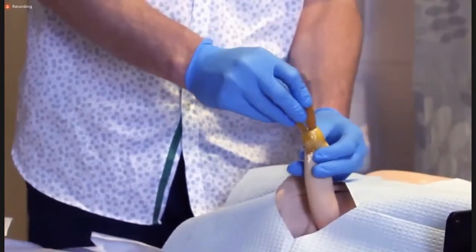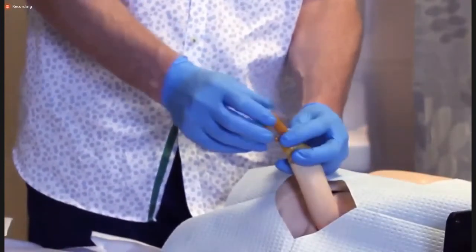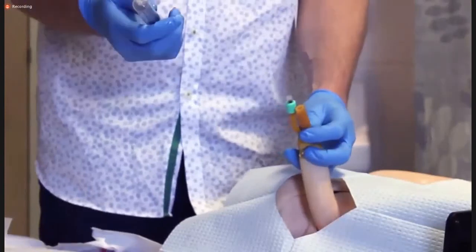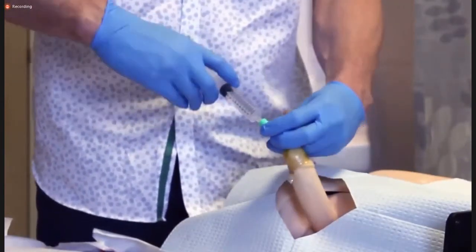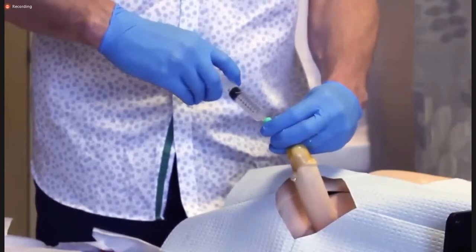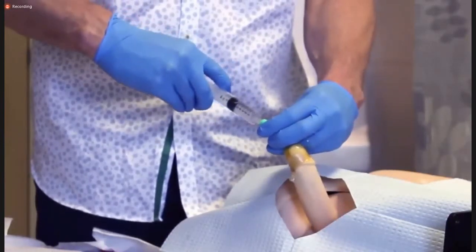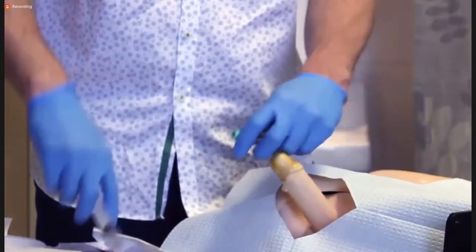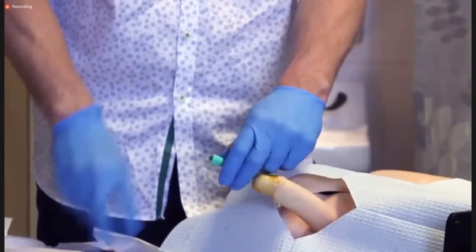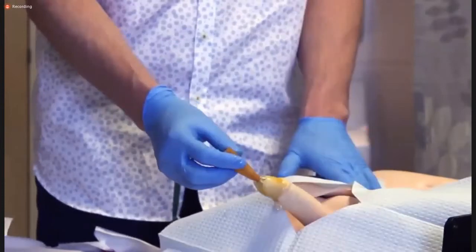Once the catheter is in, all the way up to the hub, you can then subsequently take your syringe, insert it into this port, and you can subsequently inflate the balloon with a total of 10 cc's. So in this case, we'll inflate the balloon partly. Then what you can do is sometimes push gently on the bladder to make sure you get urine back.